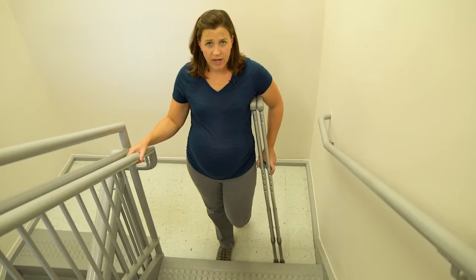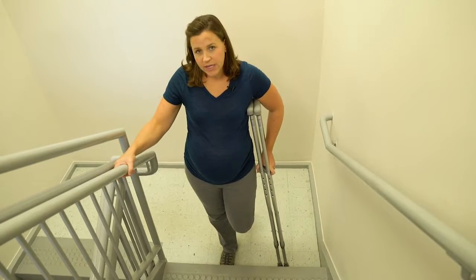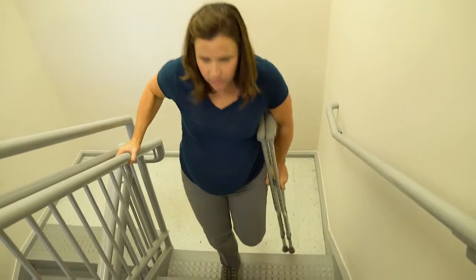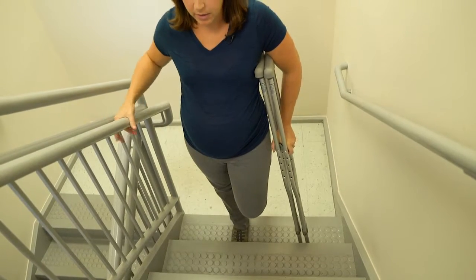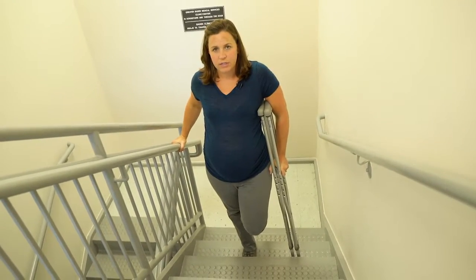If you can't put any weight through the leg, you're going to put it behind you as you go up the stairs. Still going to use the hand on the railing if you have one and pushing through the crutch. You're going to hop up and then bring the crutches up with you, never placing any weight through that leg. Again, pushing through the crutches and the railing to hop up and bring the crutches back up with you.